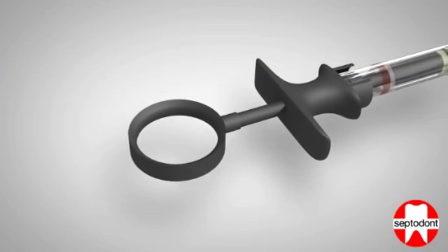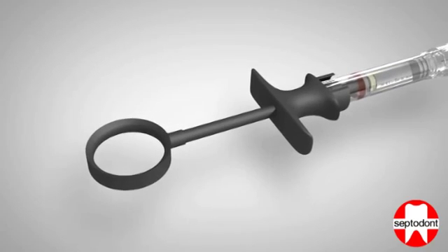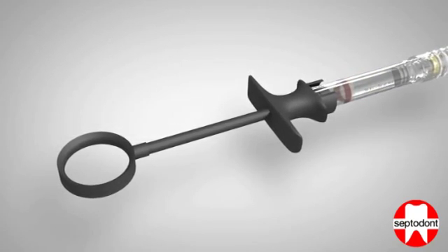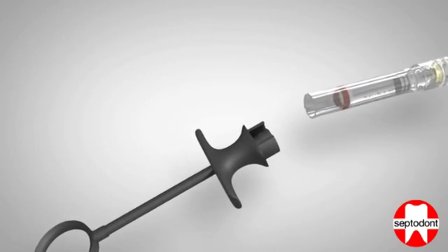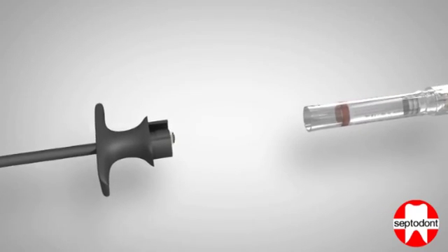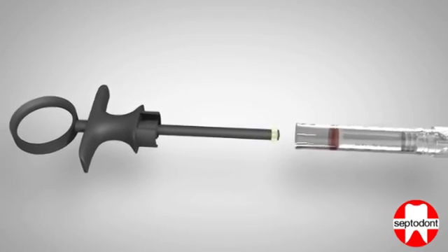If you wish to remove the cartridge from the syringe prior to disposal, pull the handle plunger back fully, ensuring that no part of the plunger remains inside the glass body of the anesthetic cartridge. At this point, separate the handle from the syringe body and extend the tip of the plunger.